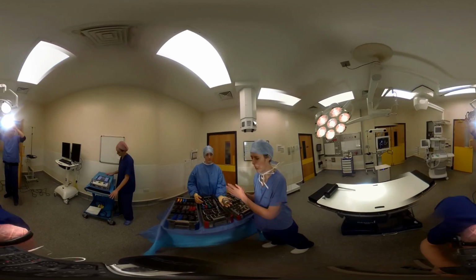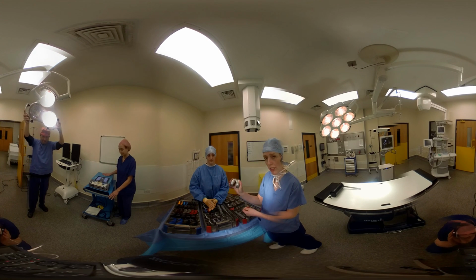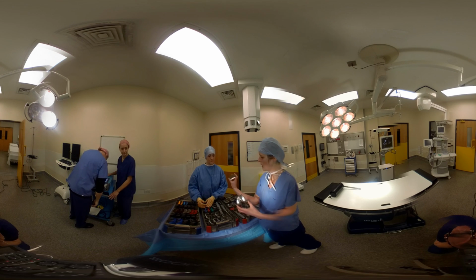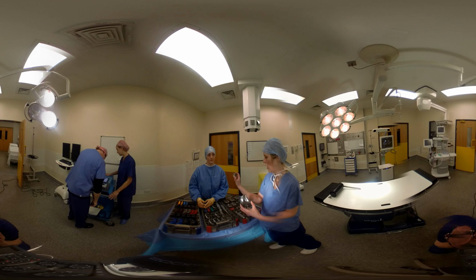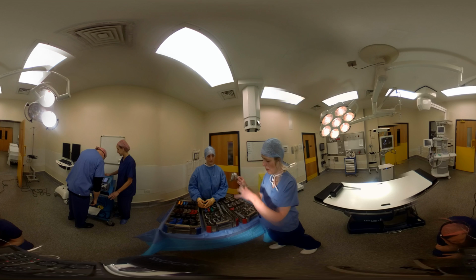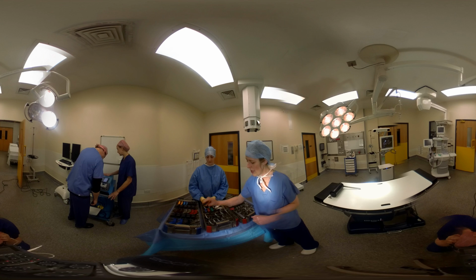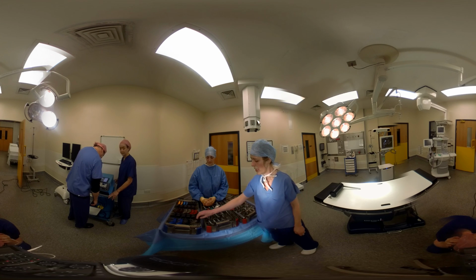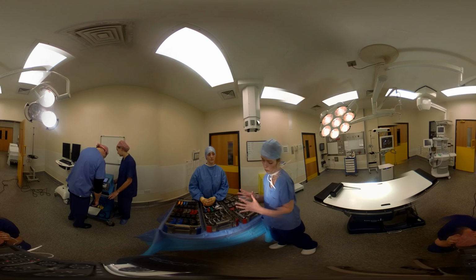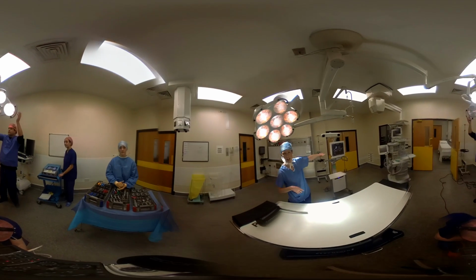Normally these would be sterile. I'd have gloves on whenever I'm handling this. This is a trial femur implant, which means the end of your thigh bone. First of all, we've got all these special jigs that we use to cut your shape for your new thigh bone, and then put this on the end, and then there'll be a similar thing for the top of your shin bone, your tibia, and then these are spaces that go between the two, and so on the table we can make sure that you've got the perfect implant that's going to fit you well and last you a long time. And then this is when I'm doing a knee replacement.